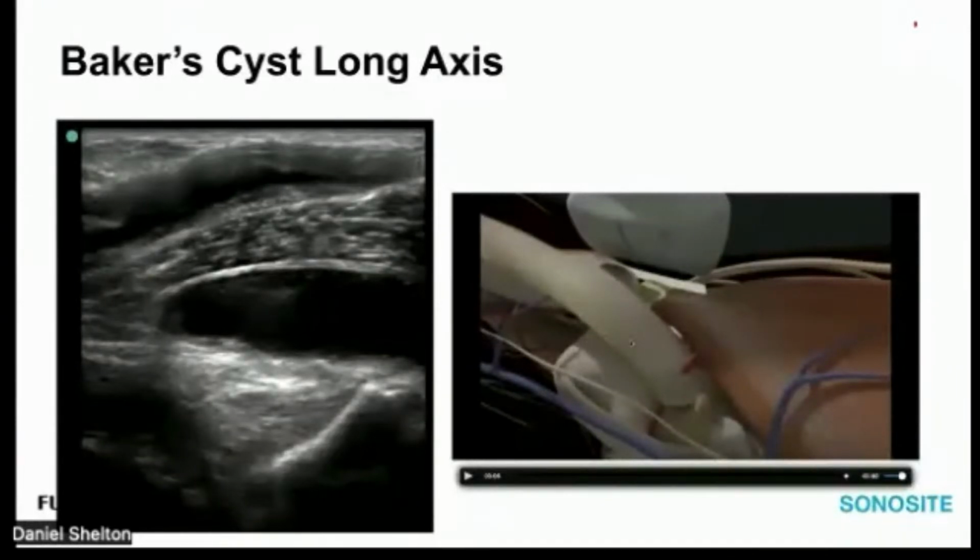So proximally to distally, we've got the semimembranosus diving to the posterior tibia. And then distally, we've got the medial head of the gastrocnemius muscle tapering to this kind of funnel feather-shaped tendon that borders the medial head, the semimembranosus right there, and it dives in the opposite direction. So that's when I say in short axis, you're going to get one to be bright and the other will be dark, vice versa.